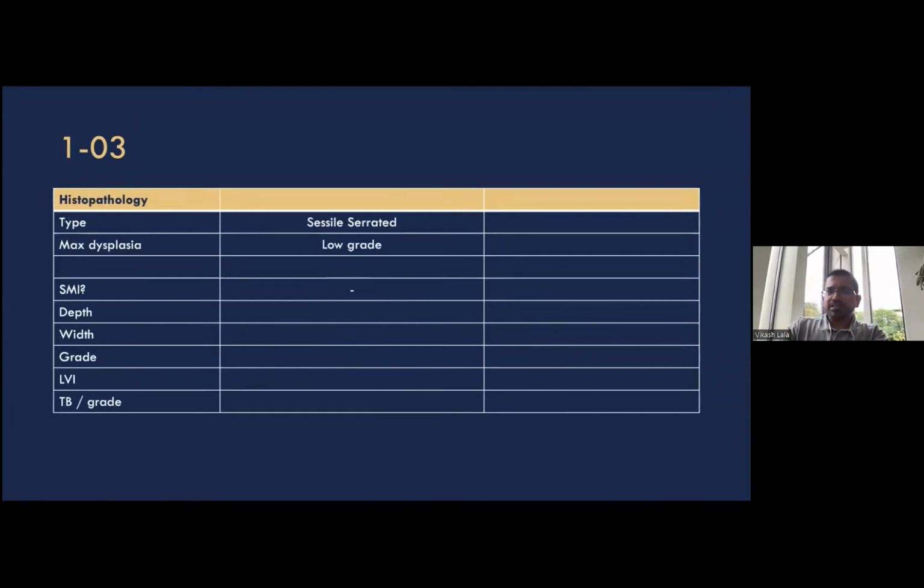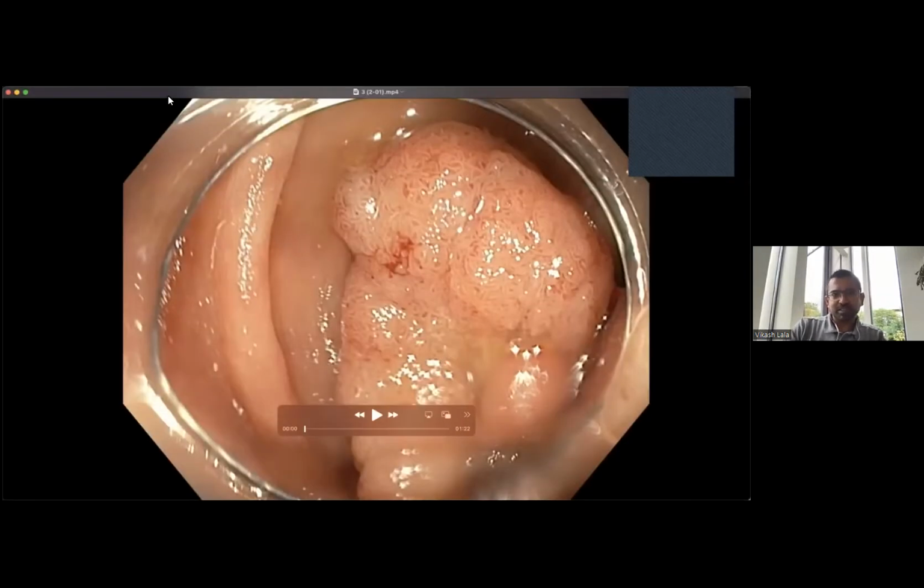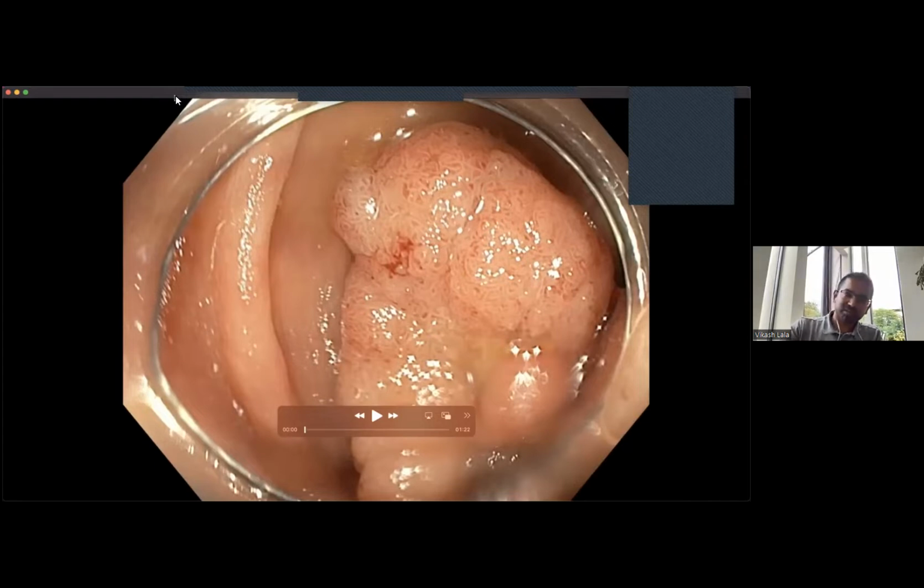All right. Just to make a comment, I think just to clarify something, we may have joined a little bit later, so she may have missed that section. Hi, Neil. The demarcated area principle is within the polyp and not actually the border or the margin of the polyp itself. It's to look for a demarcated area within the polyp, not the actual border of the polyp.